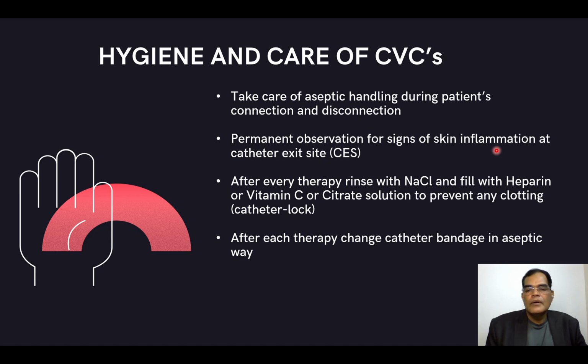And we have to flush the catheter after the dialysis with sodium chloride solution and use an appropriate anticoagulant, either heparin or citrate, or any other catheter lock solution which is practiced in the center. So this has to be thoroughly followed, and there is a right method of doing it which will come in the subsequent slide.